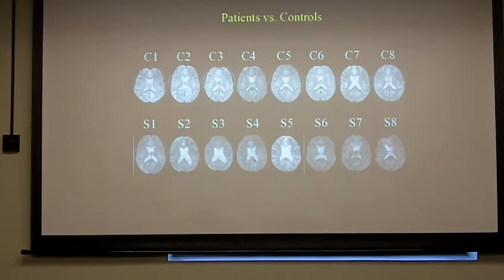Right. How do you then measure, on what basis do you then measure the brain atrophy? Right? Are you not sort of taking it away in the warp?